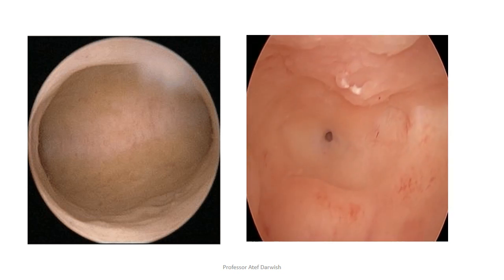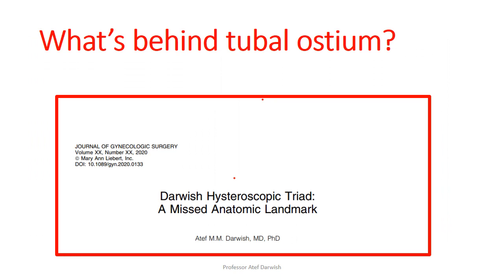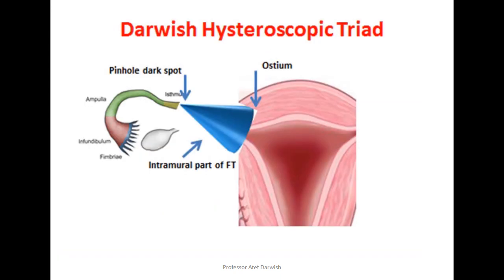At the cornual ends you can use the ostia as landmarks, but what's behind the ostia is not well described by hysteroscopic examination in many cases. So we have to evaluate what's behind the ostia, and this can be achieved by describing what's called the Darwish hysteroscopic triad.